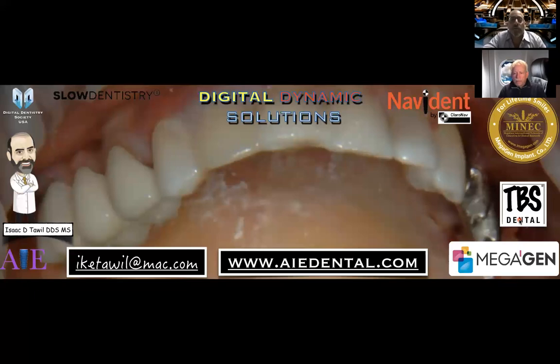But they are doable, they are possible. It's not a case I would start with, but certainly ones that we do quite often in the practice here. We've been doing socket shield and partial extraction therapy for 8 years, and it's become commonplace for us. Those are actually now my favorite cases, because I'm usually thinking immediate load same day.